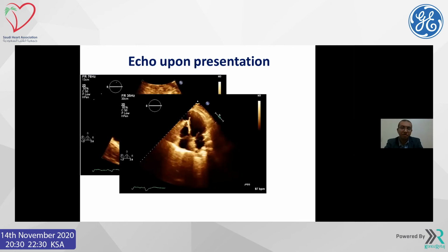Well, it seems that he has developed a large pseudoaneurysm of the apex. His apex is akinetic, scarred. You can see a very thin septal wall there, which is part of the apical wall, and there is a big pouch just above the RV, which I think is a pseudoaneurysm. Okay, excellent. Continue, Ayman, please.